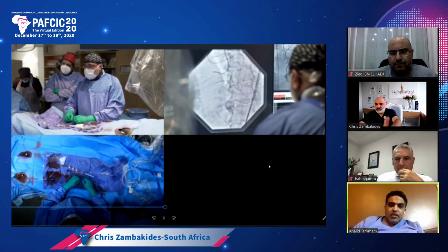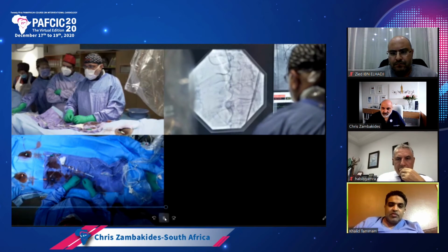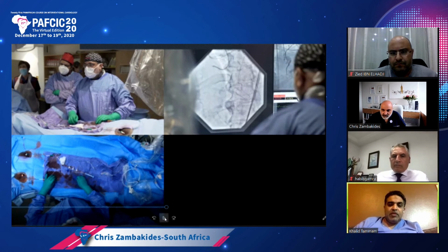So, Dr. Chris, let me ask you here, while you are trying to go through the stent with the Gaia: do you think it's better to have a supporting Guideliner or Guidezilla before you start, to get better support and more control for the microcatheter?